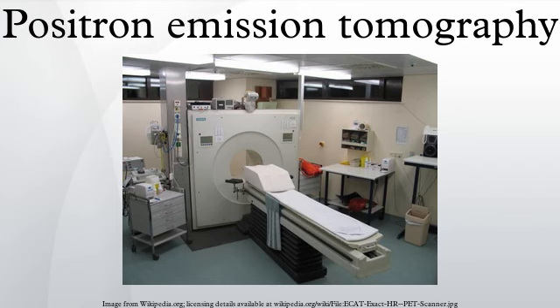Neuroimaging. Neurology. PET neuroimaging is based on an assumption that areas of high radioactivity are associated with brain activity. What is actually measured indirectly is the flow of blood to different parts of the brain, which is, in general, believed to be correlated, and has been measured using the tracer oxygen-15. However, because of its 2-minute half-life, O-15 must be piped directly from a medical cyclotron for such uses, which is difficult.